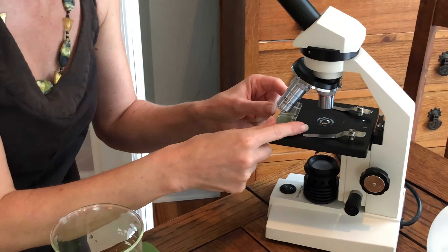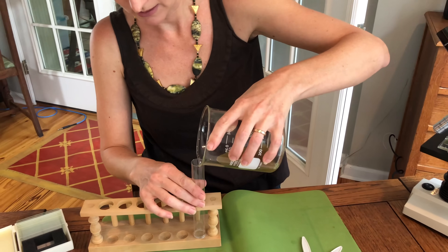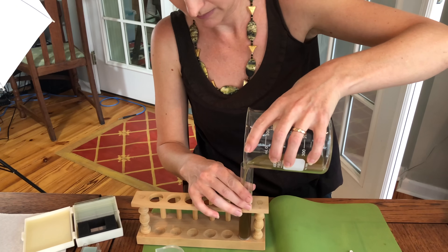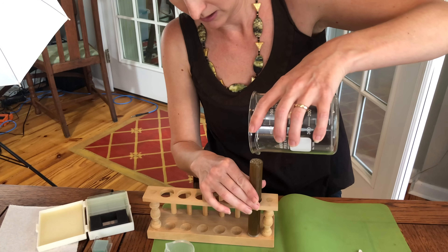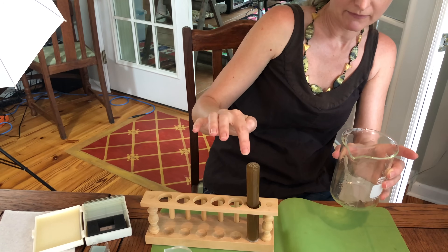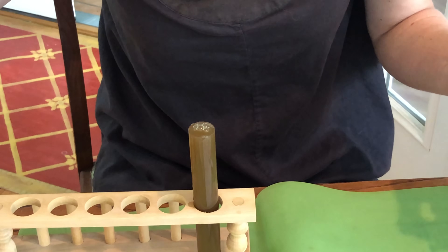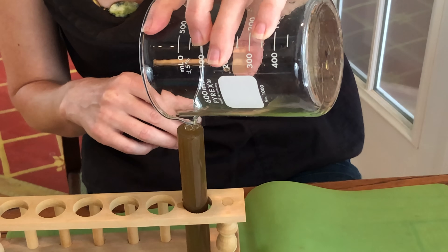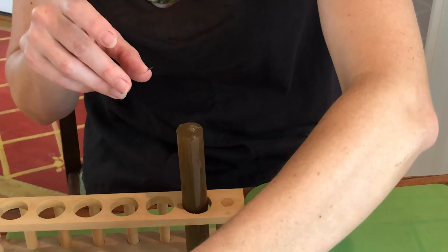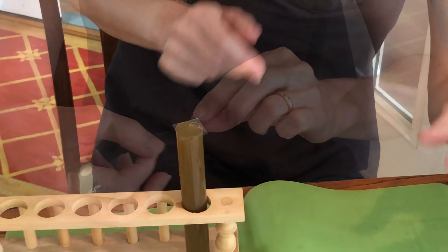For the test tube method, fill the test tube up to the top until you have a meniscus — like a little bubble over the top — but it's not dripping off the sides. Once you've got it like that, take a slide cover and set it right over the top of the test tube.